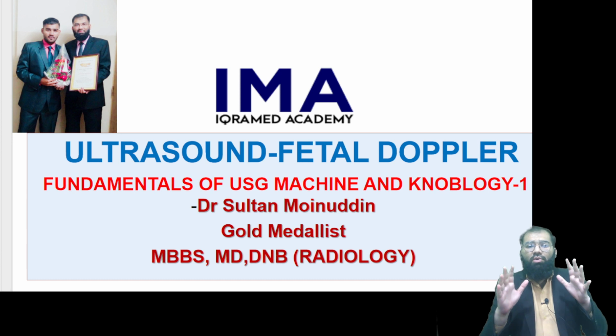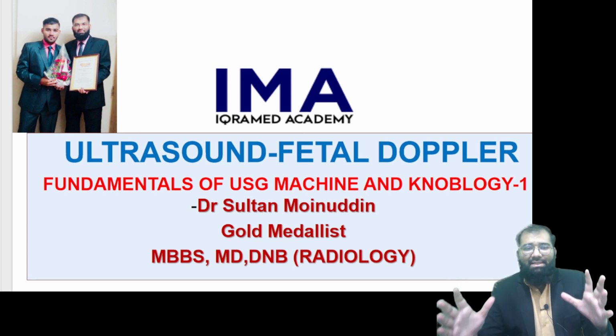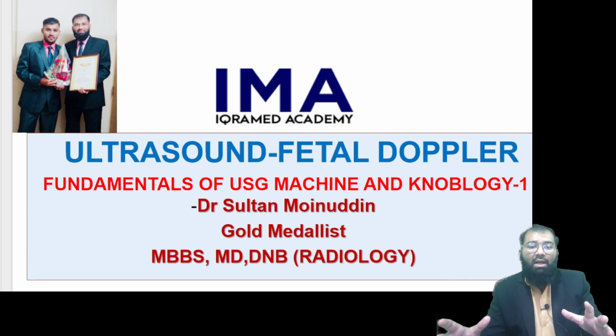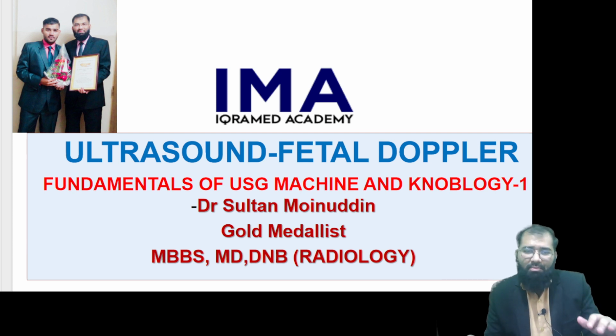One thing which I want to tell you before we start with this is that radiology is an imaging science. Sonography is an imaging science. That is, you image a patient. Always remember that any results of the image are to be interpreted in view of the clinical scenario of the patient. So depending upon the clinical status, that has to be put on.